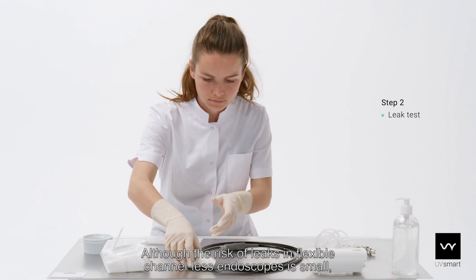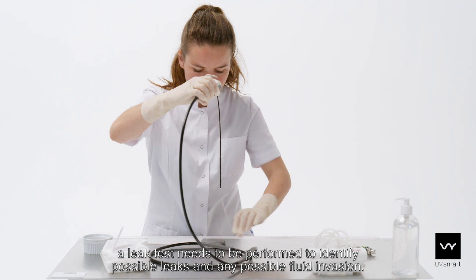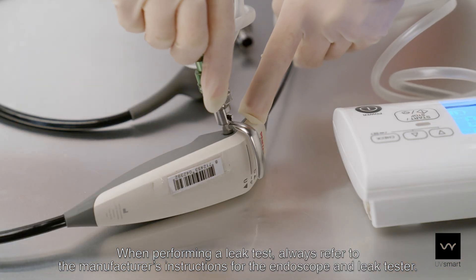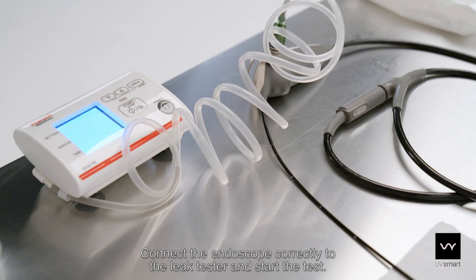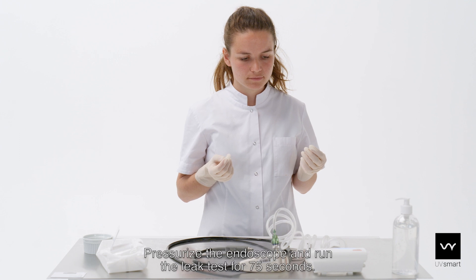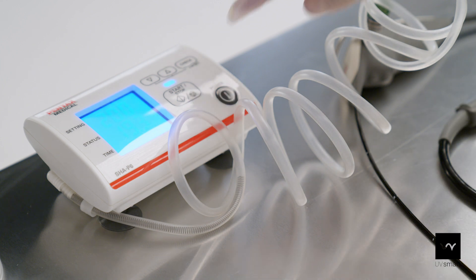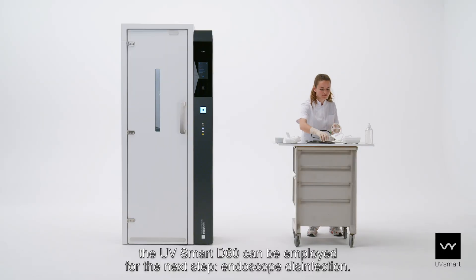Although the risk of leaks in flexible channelless endoscopes is small, a leak test needs to be performed to identify possible leaks and any possible fluid invasion. When performing a leak test, always refer to the manufacturer's instructions for the endoscope and leak tester. Connect the endoscope correctly to the leak tester and start the test. Pressurize the endoscope and run the leak test for 75 seconds. When the leak test is finished with the indication PASS, the UV Smart D60 can be employed for the next step – endoscope disinfection.